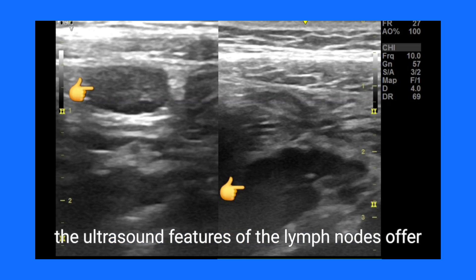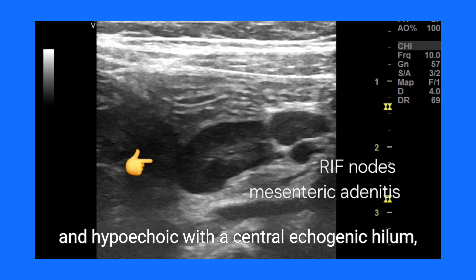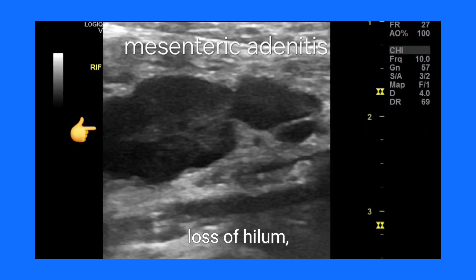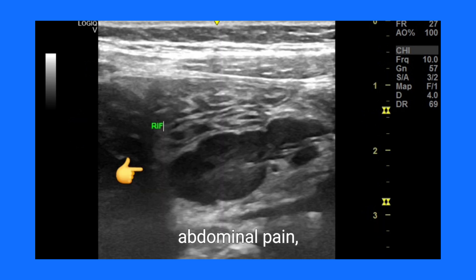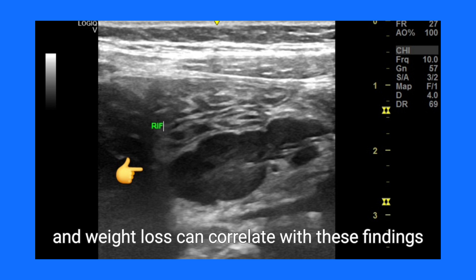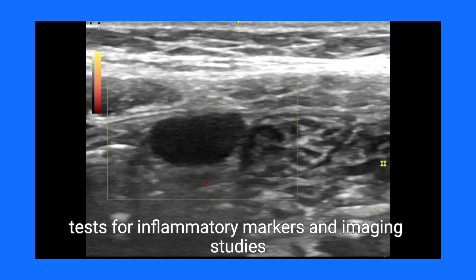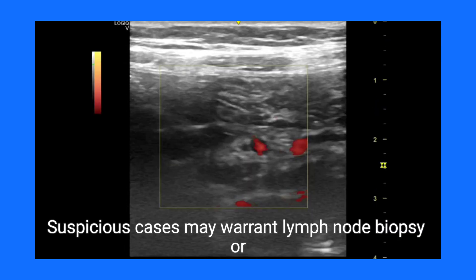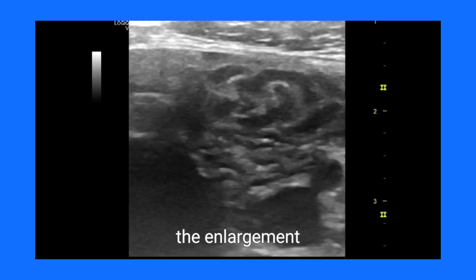To approach diagnosis effectively, ultrasound features of the lymph nodes offer critical insights. Benign or reactive nodes typically appear oval-shaped and hypoechoic with a central echogenic hilum, whereas malignant nodes exhibit irregular borders, loss of hilum, and heterogeneous echotexture. Symptoms such as fever, abdominal pain, and weight loss can correlate with these findings. Comprehensive diagnostic strategies include blood tests for inflammatory markers, imaging studies like CT or MRI for localization, and in suspicious cases, lymph node biopsy or fine needle aspiration.